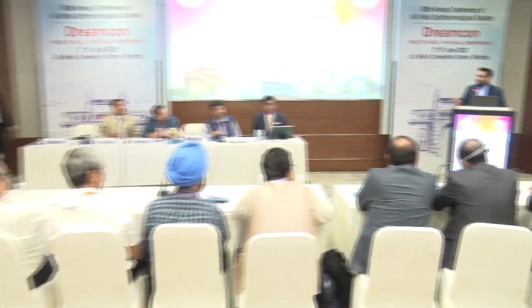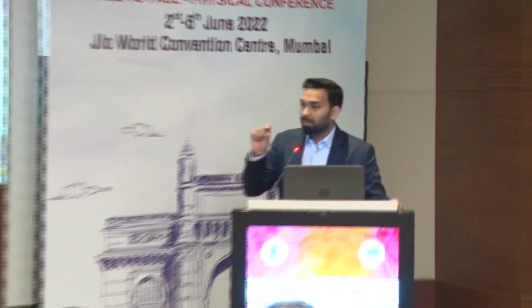Yeah. Okay. The magnification we can change by changing the diopter, but judging smaller microorganisms is a limitation right now. For fungal hyphae, it's a huge asset, but for something like microsporidia, it's difficult. It's a little difficult at this point.